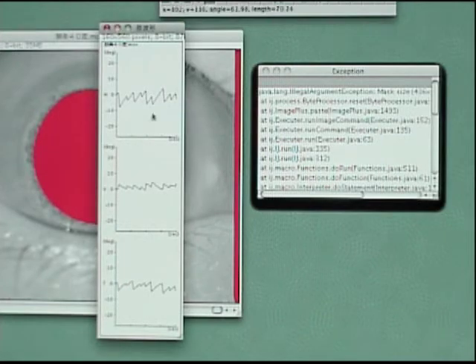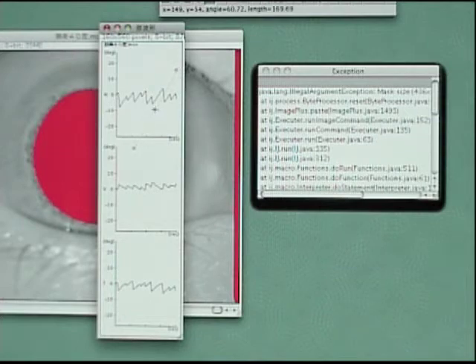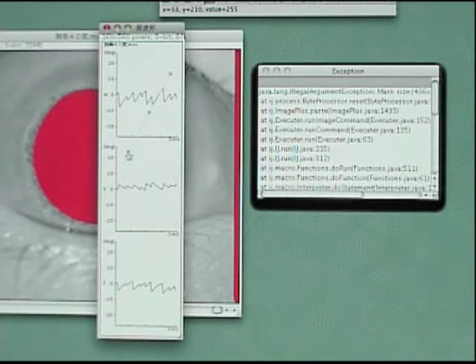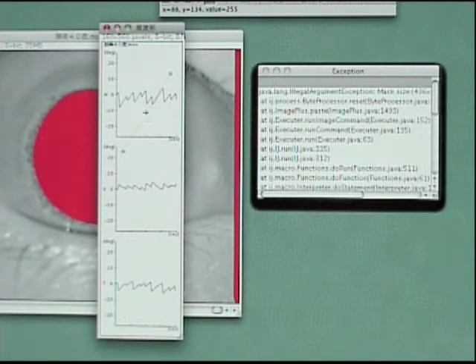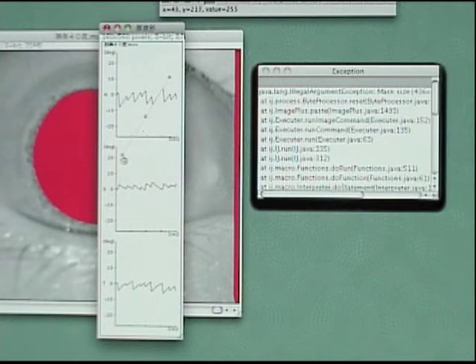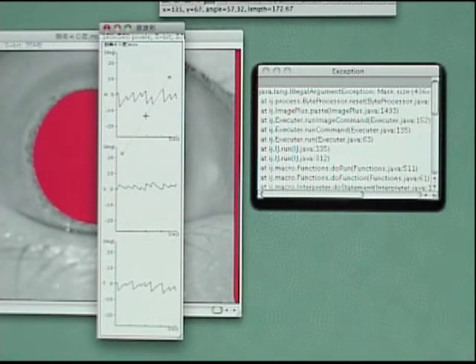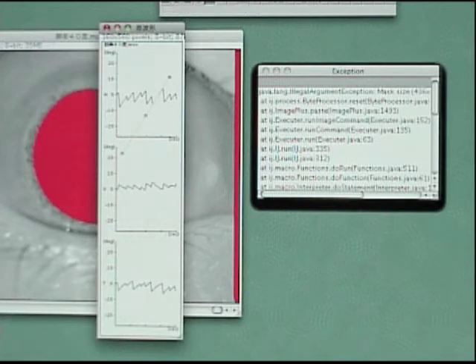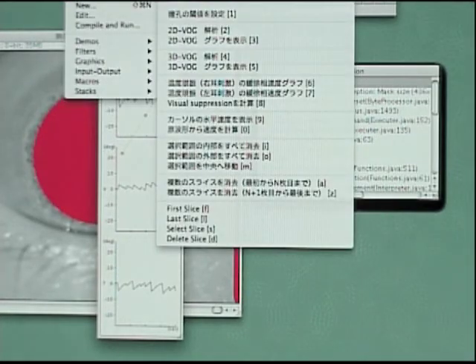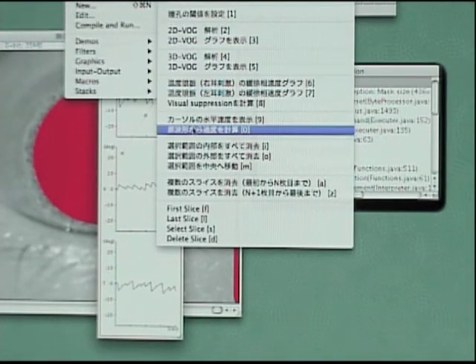For measuring slow-phase velocity, bring the line tool to the slow-phase. It is very easy to know the slow-phase velocity.